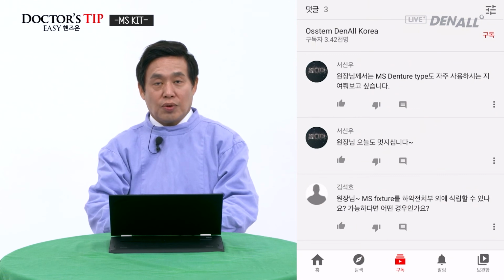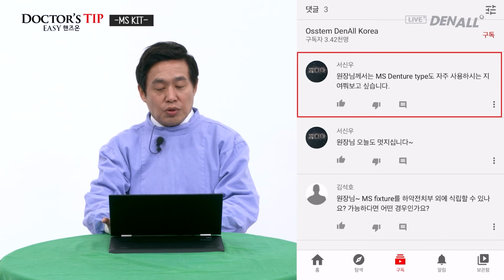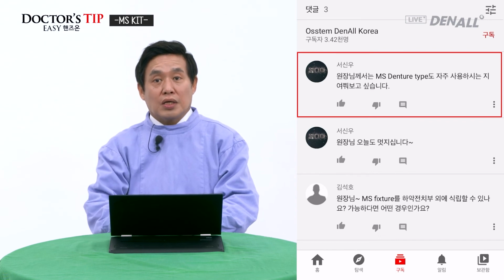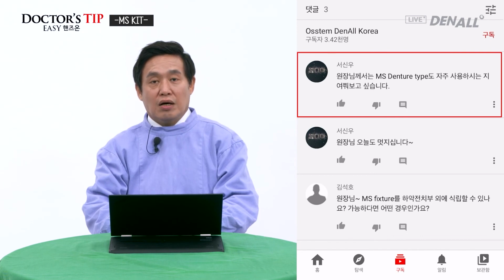So let's answer some of the questions related to MS Kit. Dr. Shinuseo says, do you frequently use MS denture type? I do believe I told you in the lecture. So the case of MS implant denture type, in overdenture O-ring connection is where this implant is used.